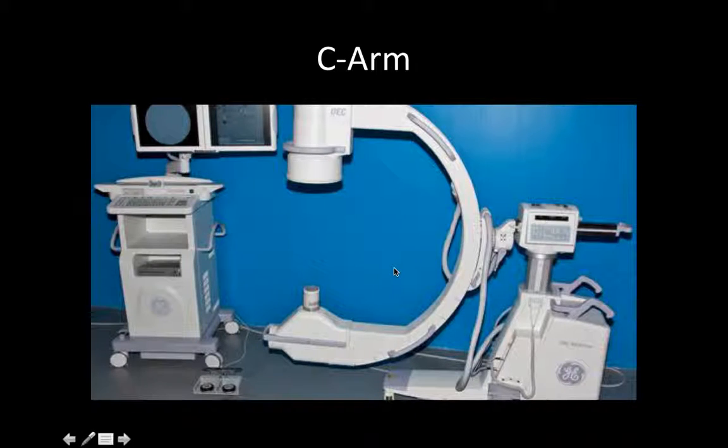That's about it for this mobile fluoroscopy, except that it does have this pedal that allows you to fluoro certain things. Some doctors like the control of having the foot pedal and allowing them to see what they want. So if they want that, set everything up as normal, throw the pedal down there, sit back and let them fluoro, keep your distance, and make adjustments as needed, however their instructions are. And that's about it.